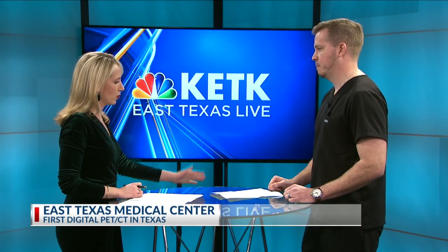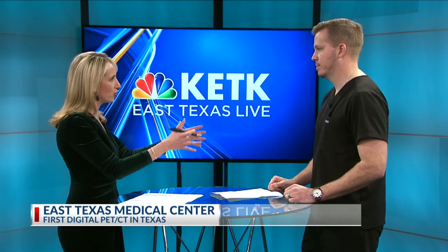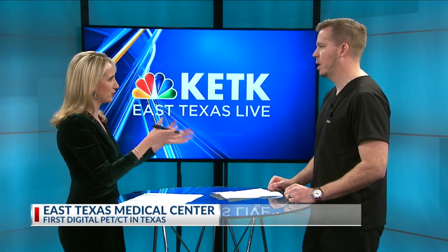Well, when you talk about it cutting the time, because I know with an MRI they're almost kind of stuck in a tube, how does this work for the patient with this imaging? So that's true. In the past, even a PET scanner was kind of a long tunnel. It was tighter. With digital technology, you're taking out all the analog components of the camera that would also increase the noise in the image and replacing those with digital detectors. So the tunnel itself is less of a tunnel and more of a donut, kind of like a CAT scan would be. So it's bigger for the patient. It's a whole lot shorter, so they're not really even in the tunnel that long.